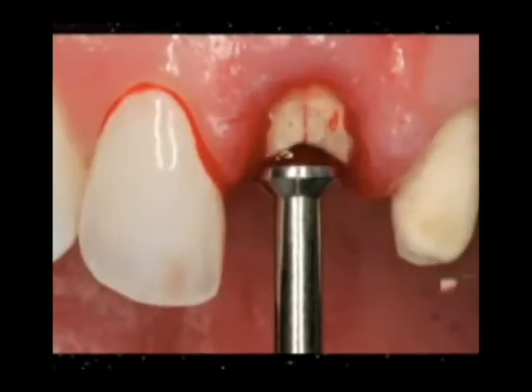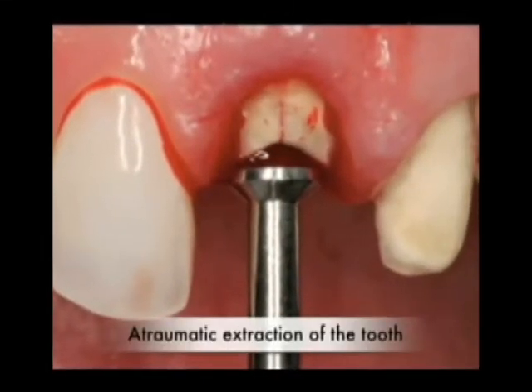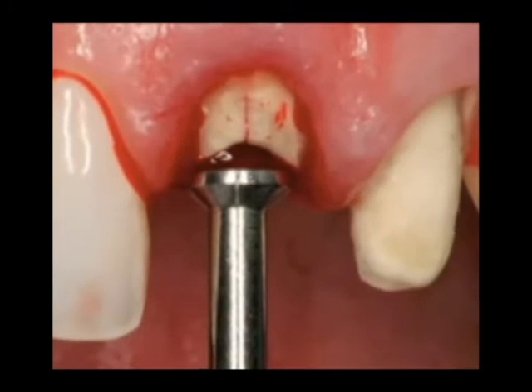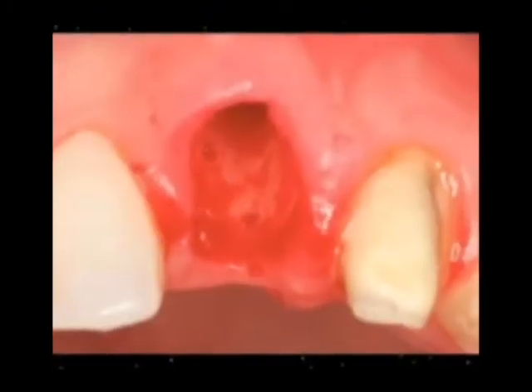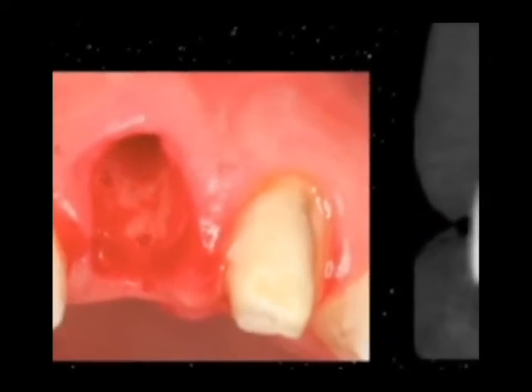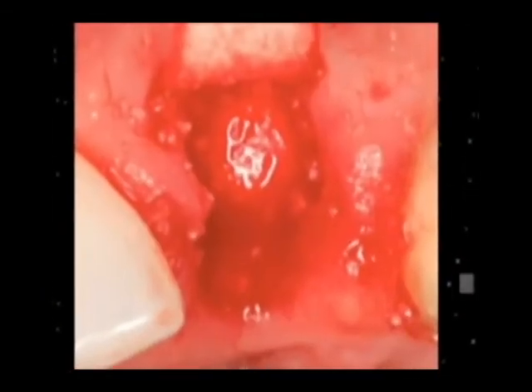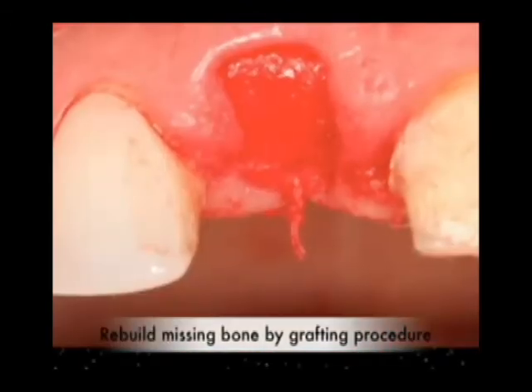The first step after the nice temporaries are made is to have the oral surgeon remove the temporaries now and atraumatically and very carefully with special instrumentation remove the bad root where the old root canal was. And with that root being removed and having special three-dimensional CAT scan documentation, we can see where we're missing bone, and we can actually, with special types of membranes and bone graft material, rebuild that bone.